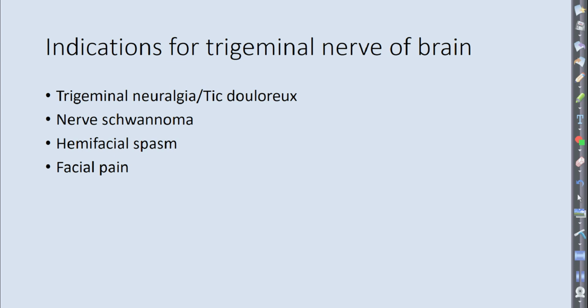Where else have you seen schwannoma? Acoustic neuroma, schwannoma. What were we scanning? IACs. If you see schwannoma, always get some slices through the IACs.